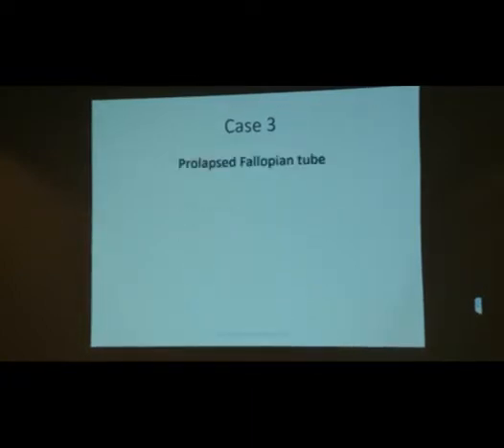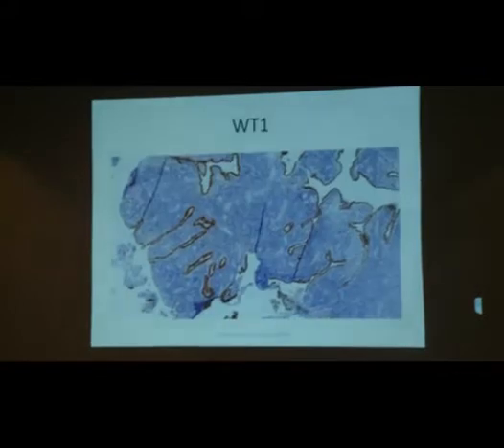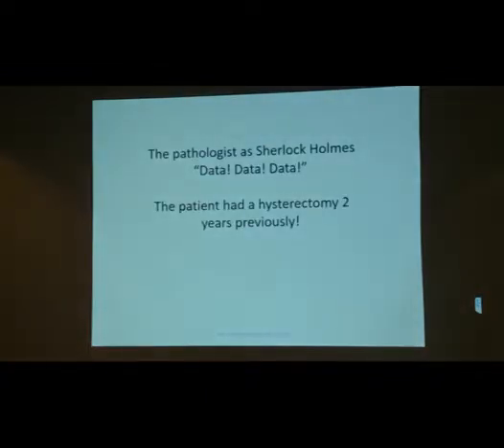Okay, this is what it turned out to be. And here's the WT1. I was very mean, I didn't show you the WT1 beforehand, but here it is. And this is what one of my favorite fictional characters said: data, data, data. Surgeons do not give us clinical information.